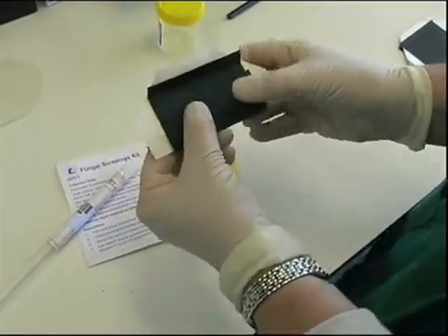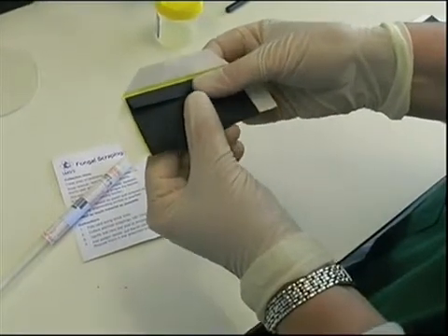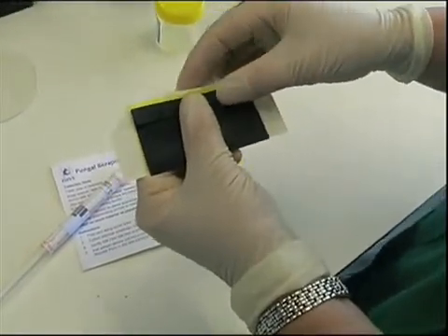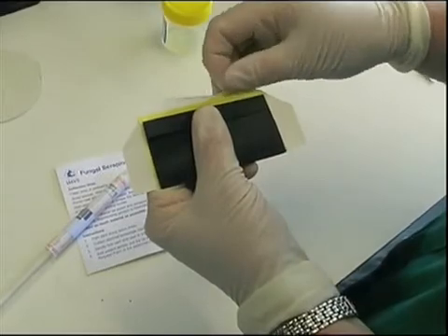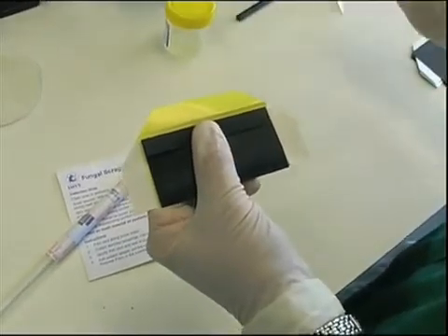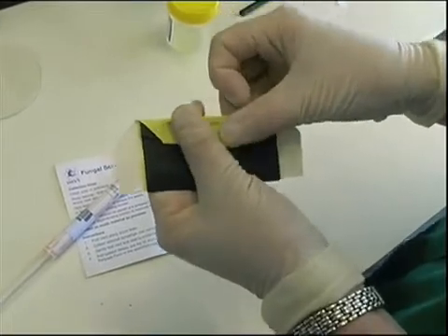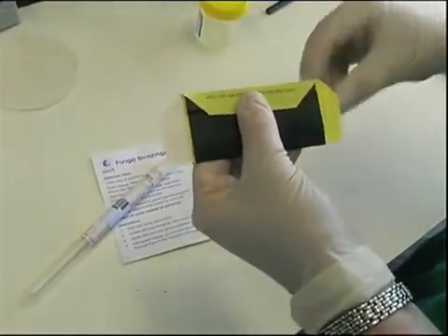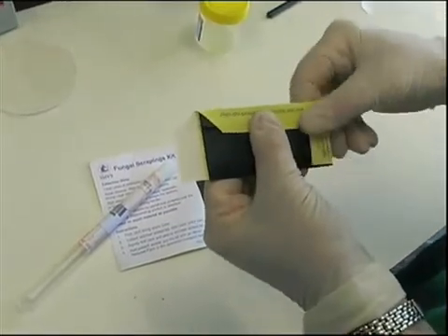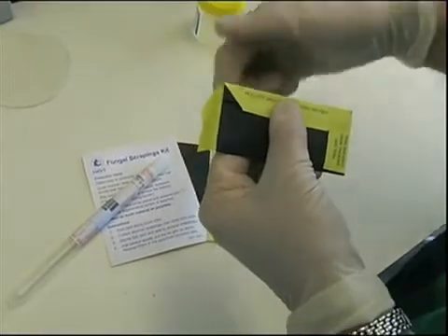Cards may then be folded and sealed. First, fold the bottom section upwards to cover the specimen. Then fold the top section over to close the card. While holding the card firmly closed, start at the top by bending the adhesive flap back to peel off the backing strip. Then firmly stick down the adhesive flap to seal the card. Do the same with the two side flaps. Finally, make sure that the card is properly sealed and labelled for transport to the laboratory.